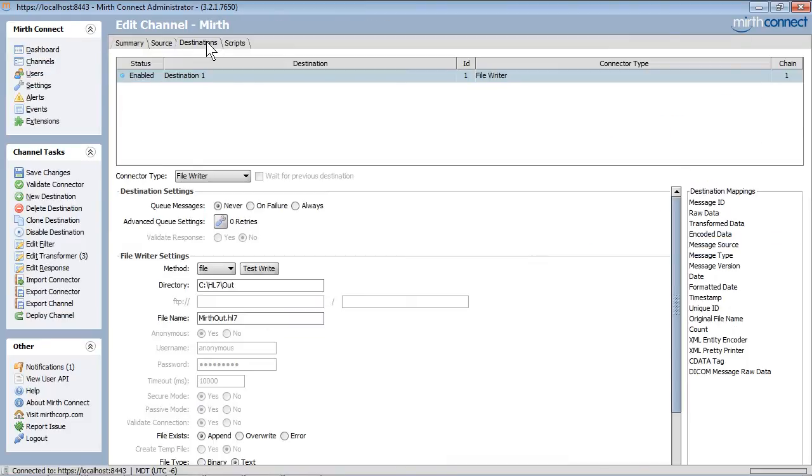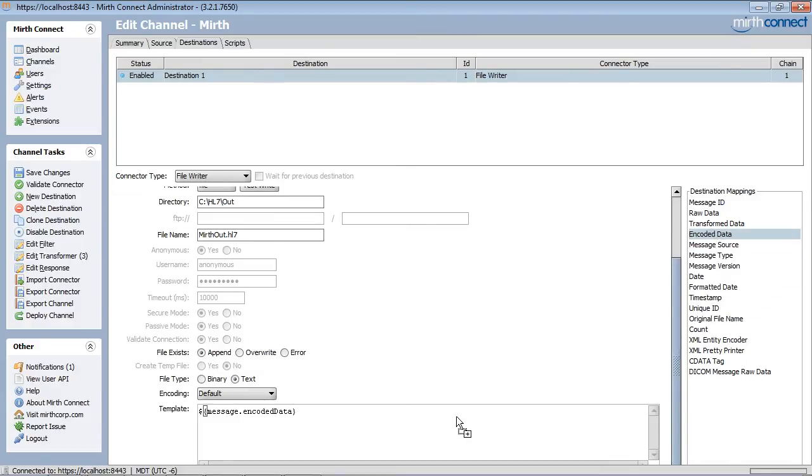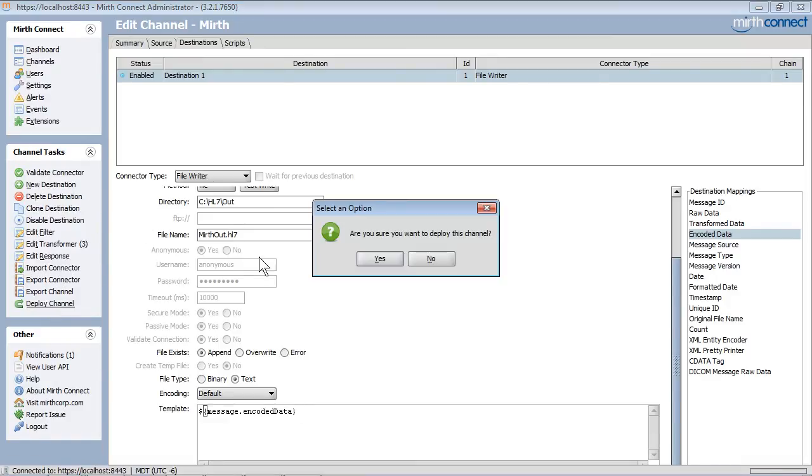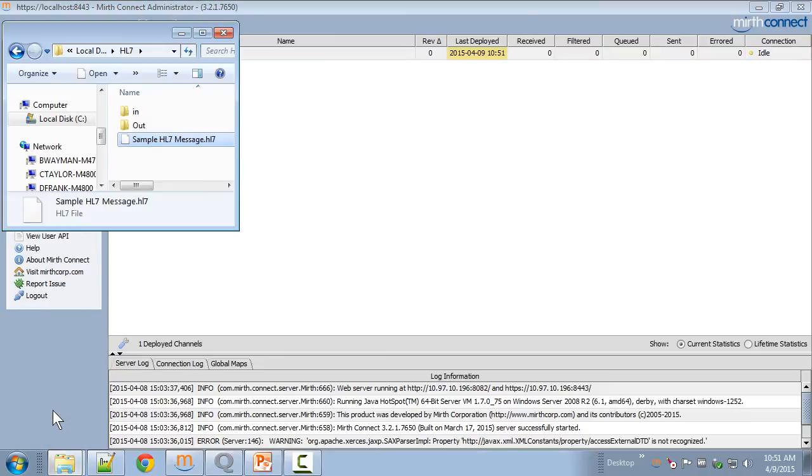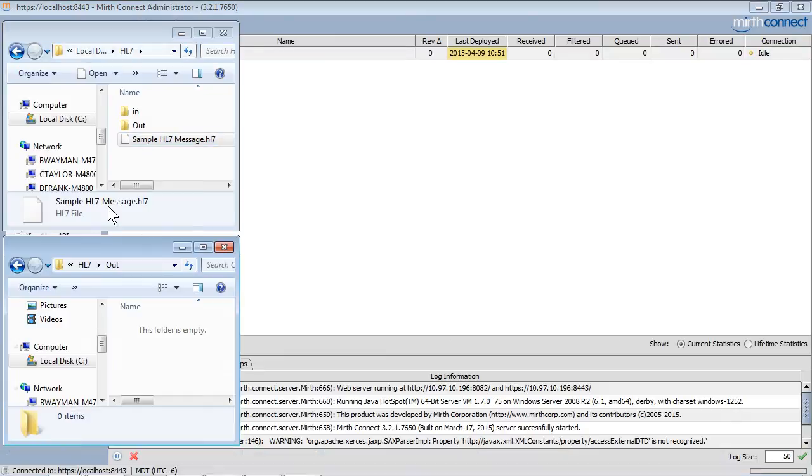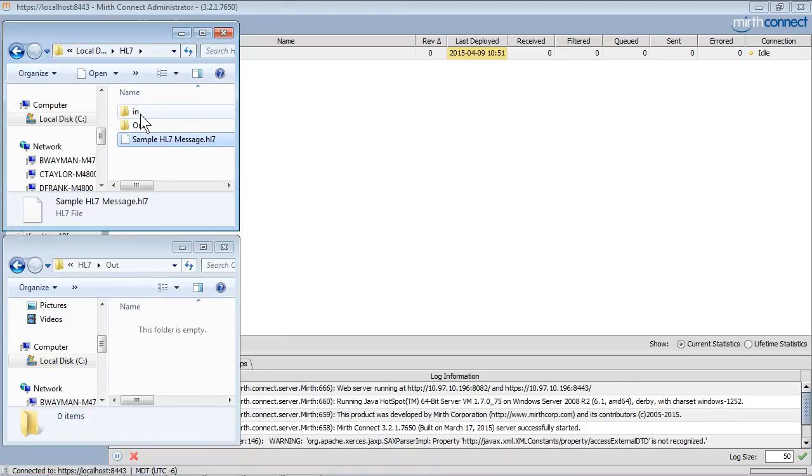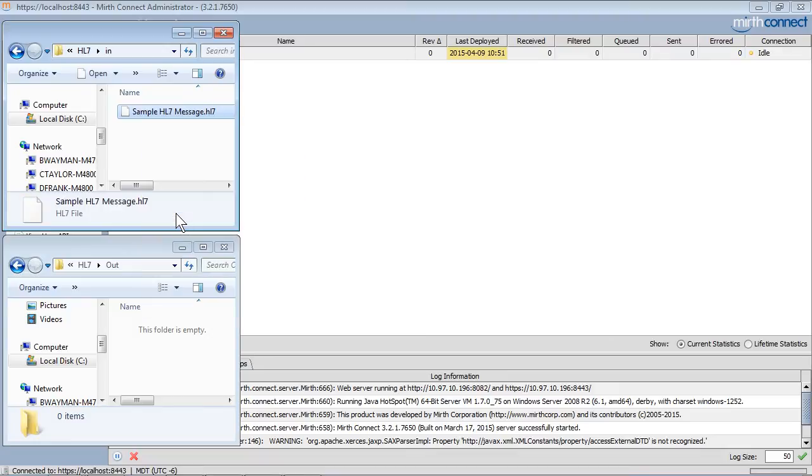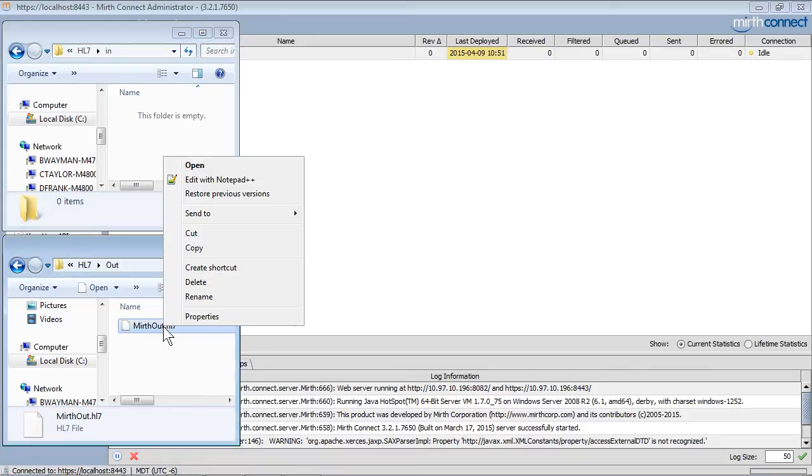We will now go back to the channel and take that transformed message as our output. We can save the channel, deploy the changes, and now we will need to run a message through the channel in order to test the mappings. I will take this sample message and put it into the inbound directory. Mirth will pick up and process the message and put it into the outbound directory.